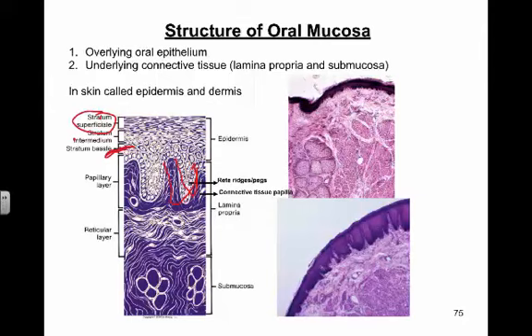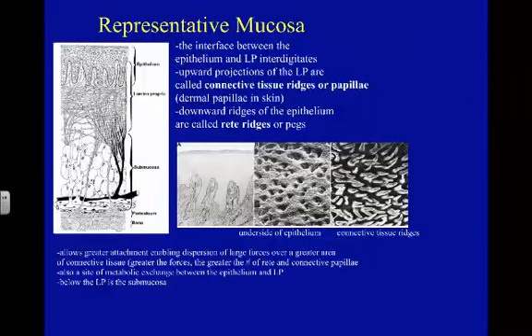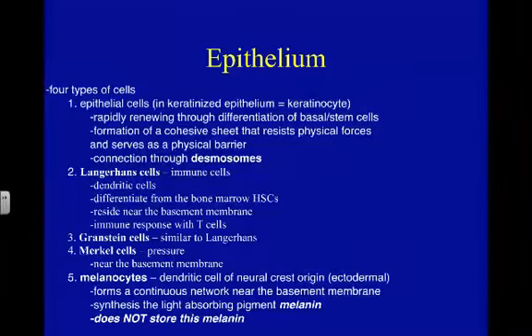Not all rete pegs are identical in all tissues. As you get older, this is a good question, obviously, we spoke about before, the rete pegs get shorter, right, and fewer in number. That's what we look like, okay? So again, this shows you the submucosa, shows you that it's highly vascular, highly neurological. Shouldn't have said neurotic, that may be driving you crazy.